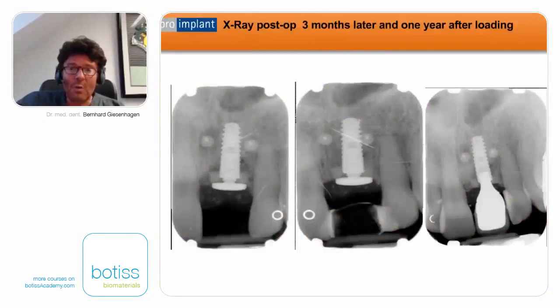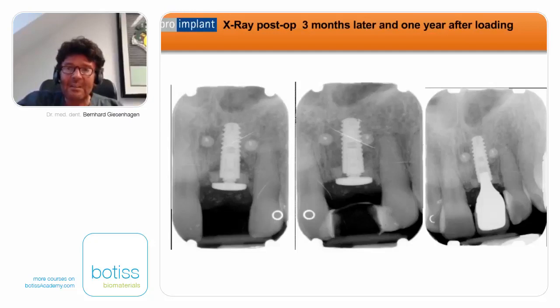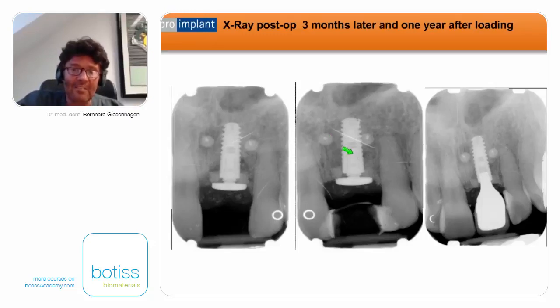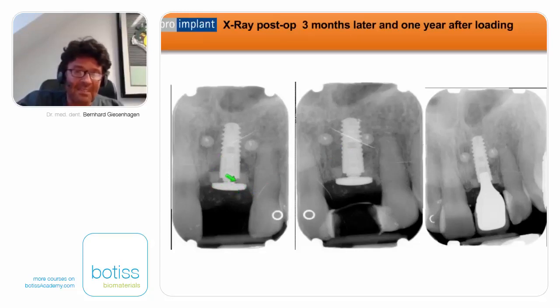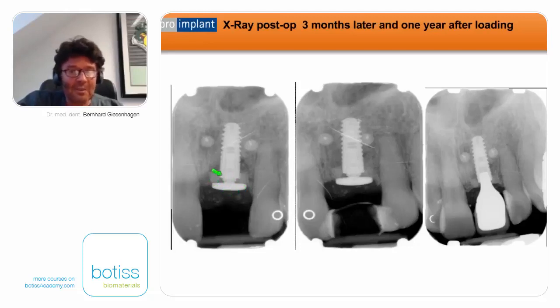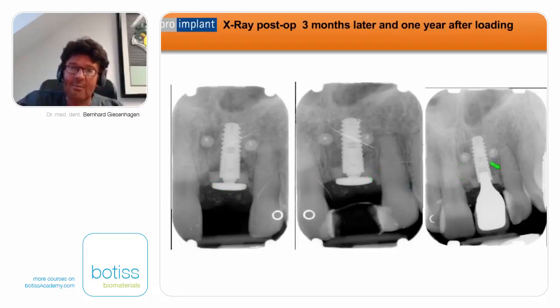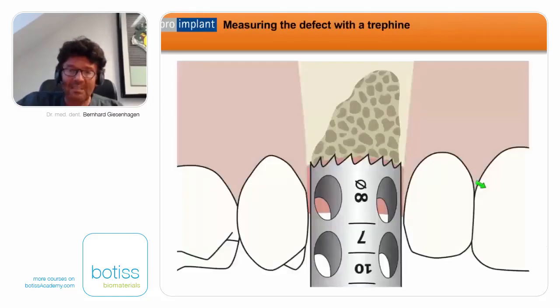On the post-op X-ray, the cortical and cancellous parts of the ring and the function of the membrane screw are visible. The implant is positioned slightly subcrestal. Three months later, bone reorganization begins, and one year later we see stable healing with stable bone around the implants.